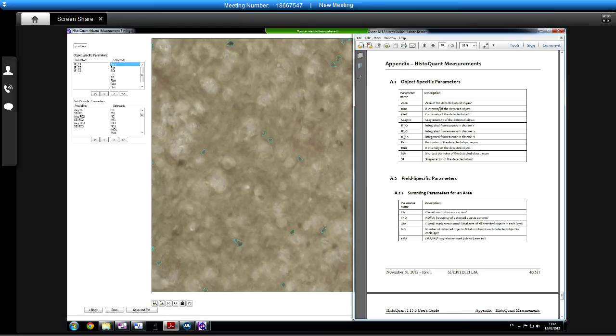And the thing I'd say about some of these parameters, you think, why do I want to know that? But this is where you might think in future about some more different ways of interpreting stuff. So for example, maybe you're doing something to your samples that damages the nuclei. And you might come to the conclusion by looking at some of them that the ones which have the higher dosage or were damaged more, they're always less perfectly circular than the undamaged cells, for instance. So you might say, okay, it's actually interesting to have the shape factor of the detected object, for instance.